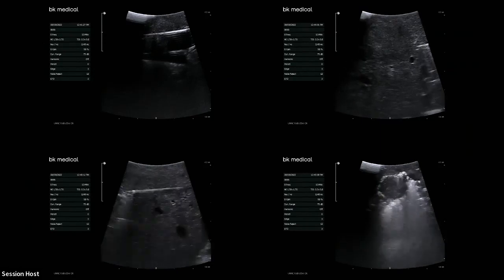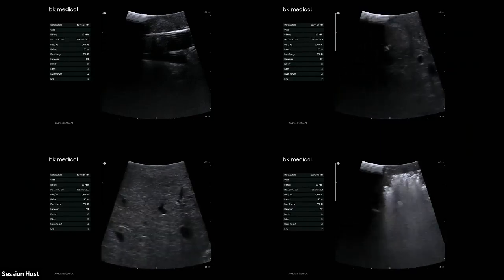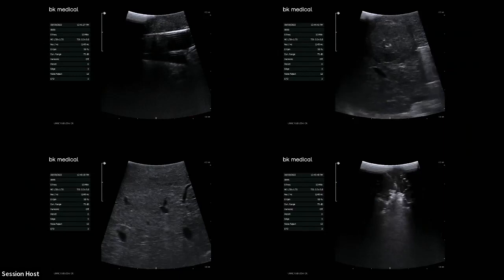Once you have a single probe in the lesion, it's very easy to hit the lesion. You already have a reference, right? Once there's one needle in a tumor, it's really simple to put the needle parallel to it. How hard is that, right? So adding an extra needle or two doesn't really change it.